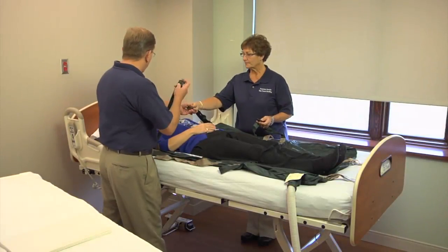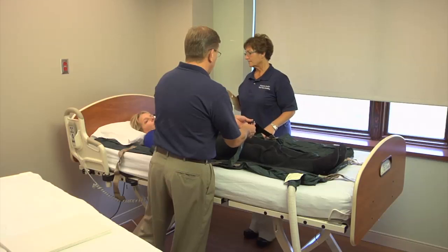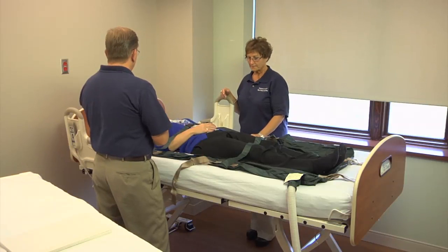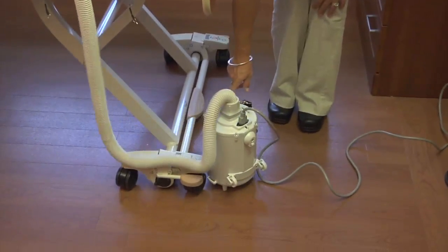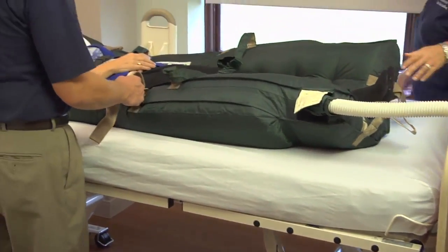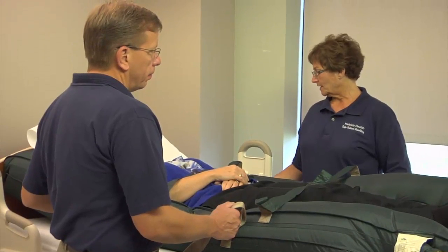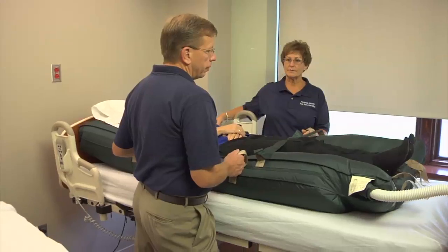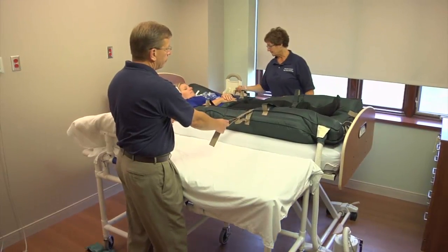What we're going to take a look at in this video is the use of what we call air assistive devices. This type of device is put on the bed and it can stay on the bed for the duration of the patient's need. It is loud, it's connected to a vacuum. The patient is strapped into it just for security. Once the vacuum is turned on, it starts to inflate the mattress. This air mat type of device is not used until it's fully inflated. The air is being forced out the bottom of it, which creates an airflow pocket that removes resistance and strain.